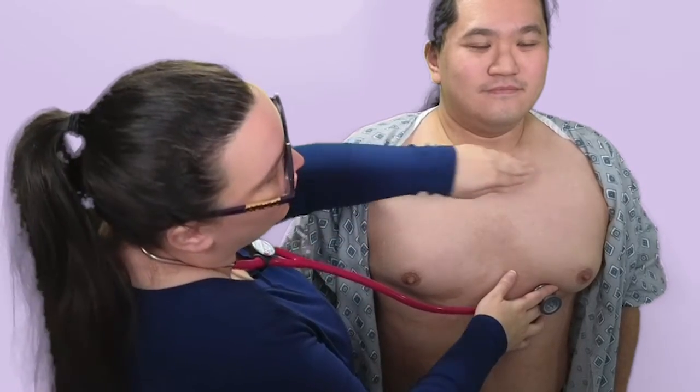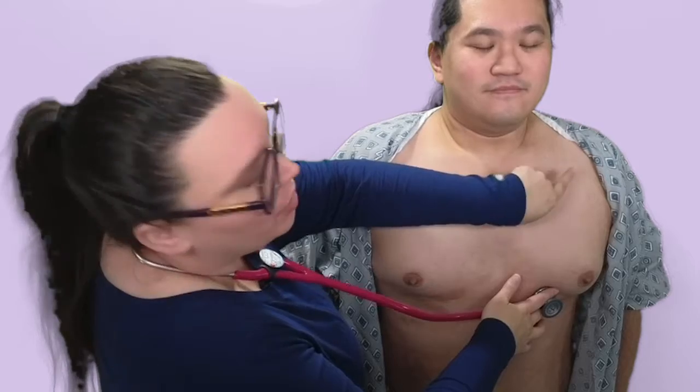We're going to finish at the fifth intercostal space along the midclavicular line, where we auscultate the mitral valve. Find the midclavicular line by dividing the clavicle in two and following that line down to the fifth intercostal space. The S1 sound is going to be noticeably louder here because it is an atrioventricular valve. This spot is also significant because it represents the point of maximal impulse, also known as PMI.